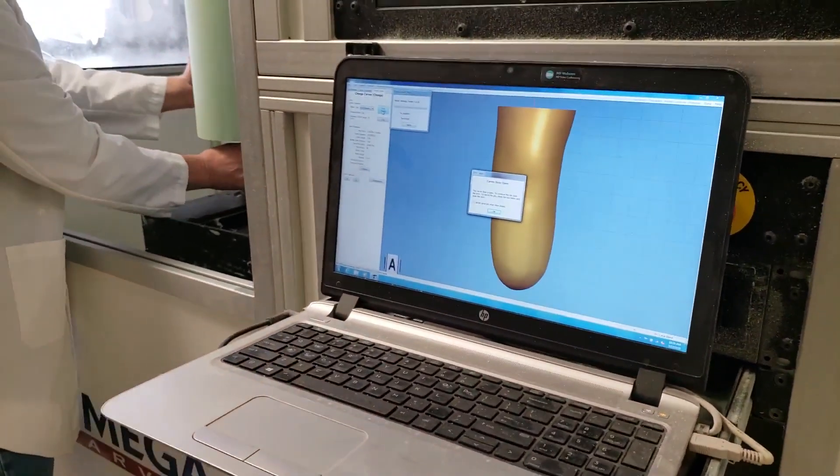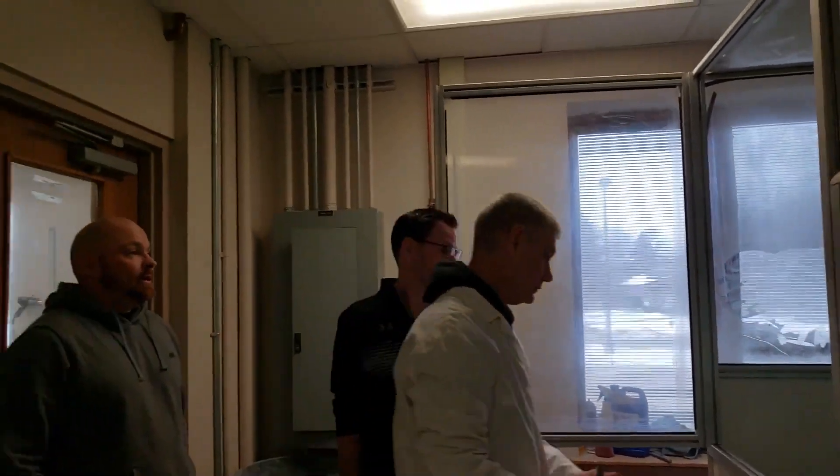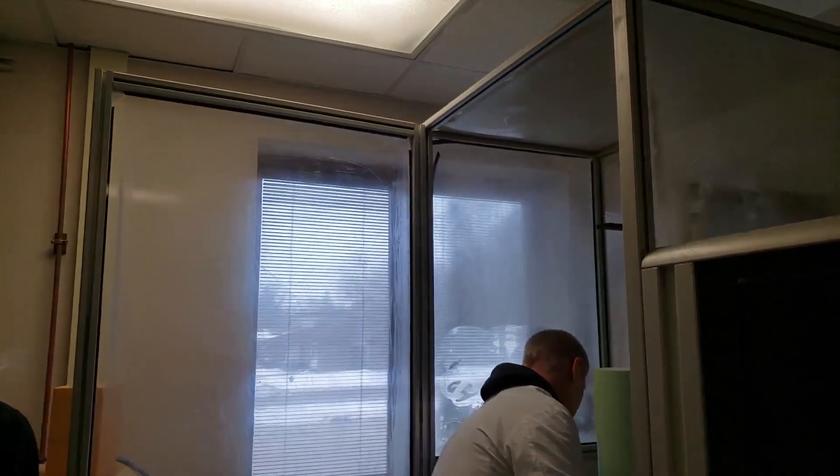Once the digital shape is complete, that image is sent to the carver, where a three-dimensional foam model of the limb will be carved.